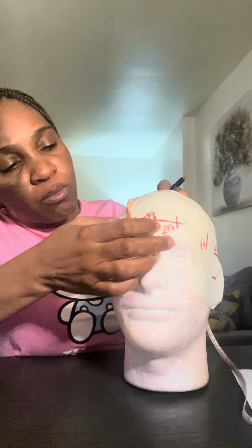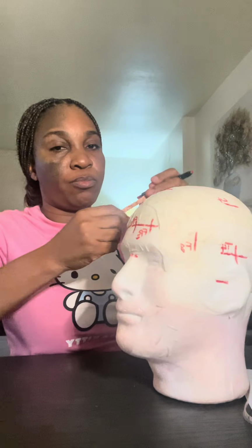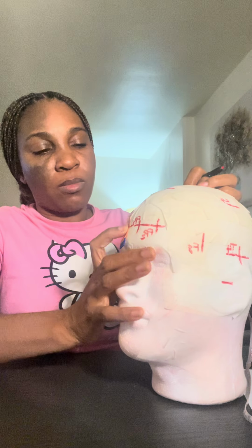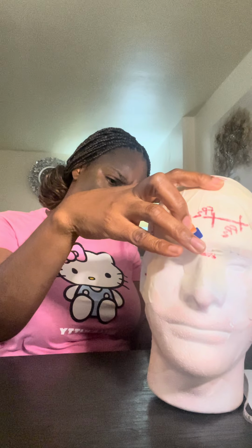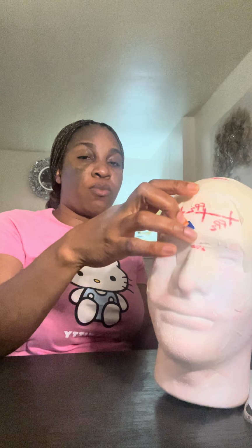So putting my 0 mark on FP1, going to C3, back to my O1, giving me 24.